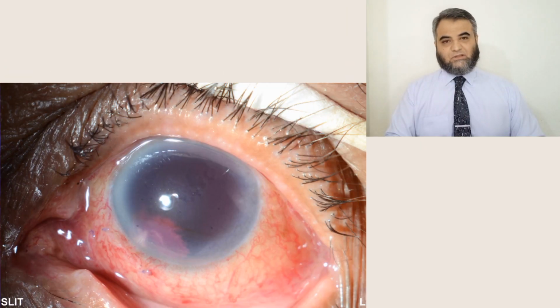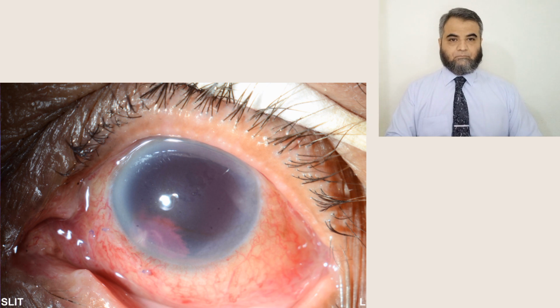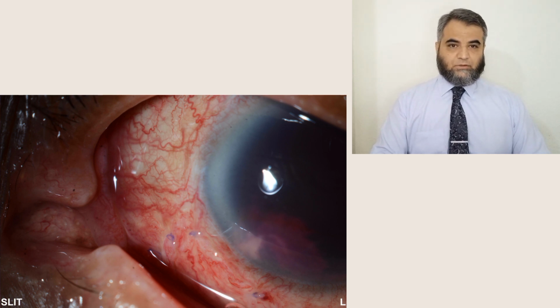You can also see the clotted blood, which is shown at 6 to 8 o'clock, and along with that there is dispersed hemorrhage, hyphema. Basically the nasal view of that one, where you can see the hemorrhage, hyphema, along with the sutures which are applied to close the conjunctiva. So this was basically a scleral fixation IOL with Prolene sutures to secure the vision of the patient.